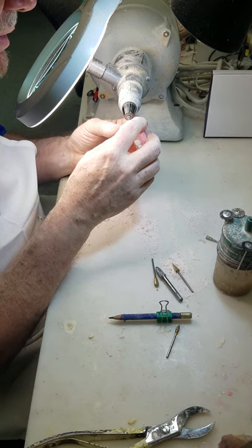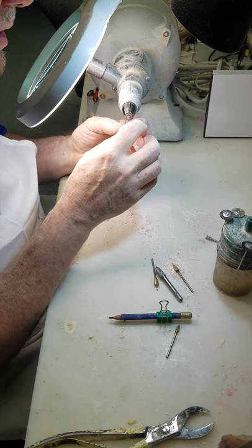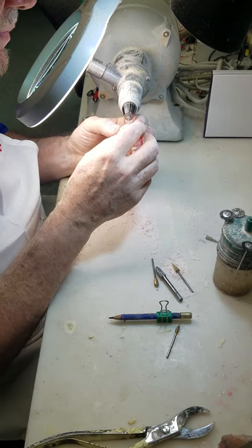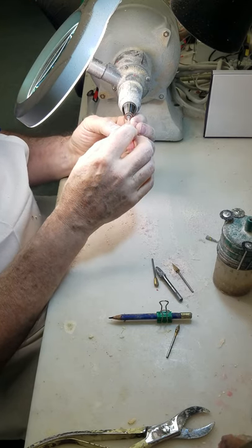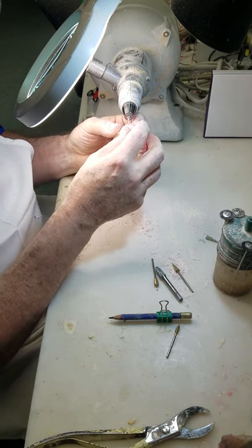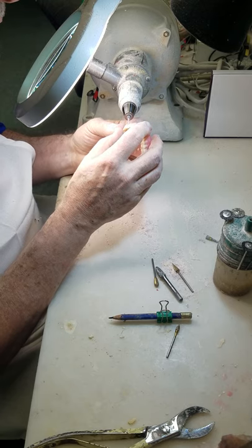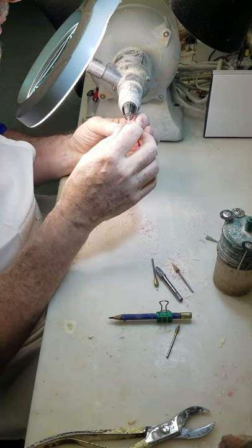There goes my timer. It will beat for a minute before it stops, so my 10-minute denture will probably be an 11-minute denture. I work under a magnifying glass and light like this. That helps me focus — it's not so much that I'm blind, but it keeps me focused and lets me do the really tight interproximal work, like getting out a bubble or a piece of stone fairly easily.